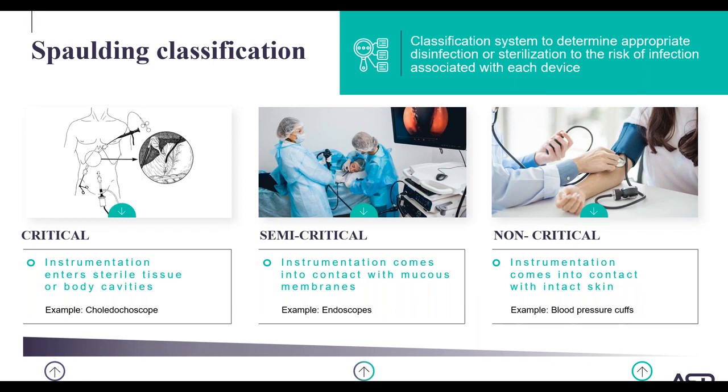And we know this can be confusing, so just to walk through a scenario that many of you have likely encountered as part of your workflow and in your workplace. If you are using forceps to take a biopsy, it penetrates tissue, and that does require sterilization. But the endoscope being utilized during the procedure is traditionally classified as a semi-critical device, and so only requires high-level disinfection. So I think this is just something that we all should be aware of and be thinking about as part of our practice.